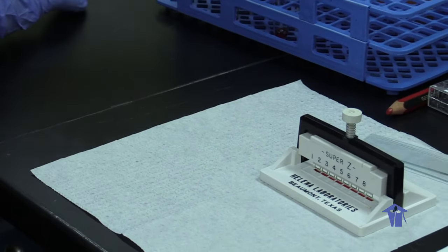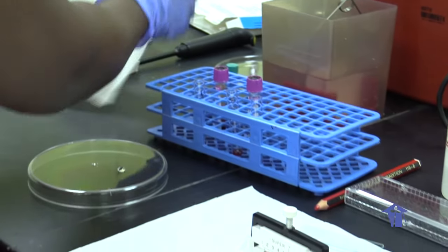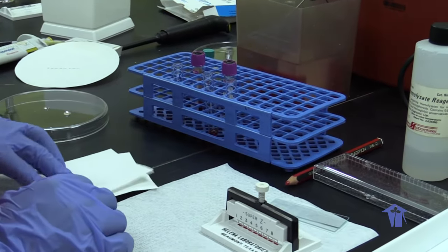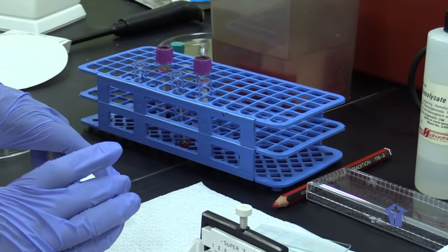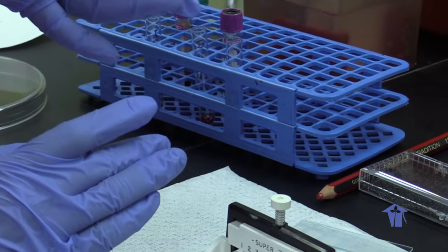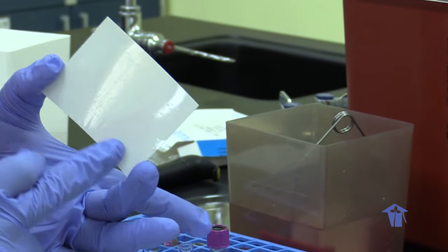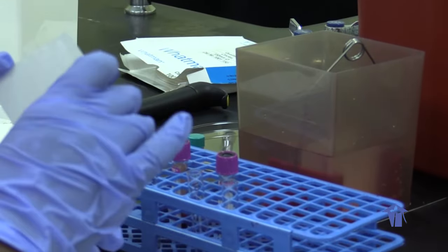Then we take out our plates. We blot dry them. This process is to get rid of any excess buffer on the plates, and also to be able to see which side is our acetate side and our glossy side. This is the side that we're going to label, so as not to mistake the acetate side for the glossy side.